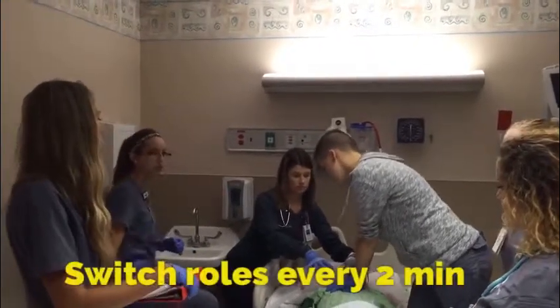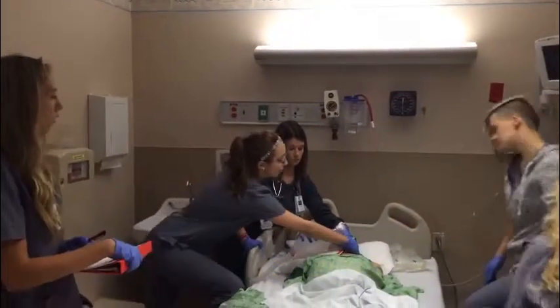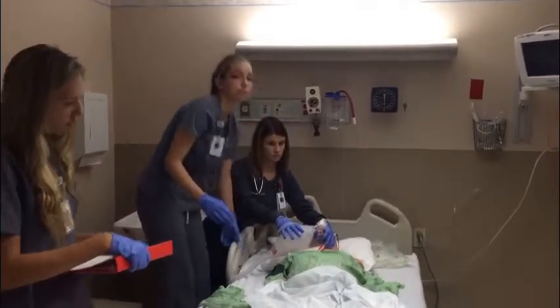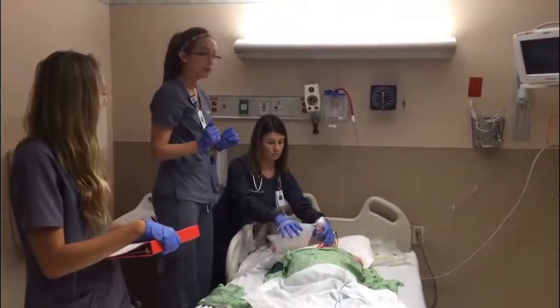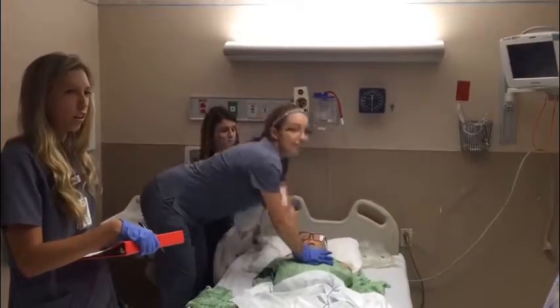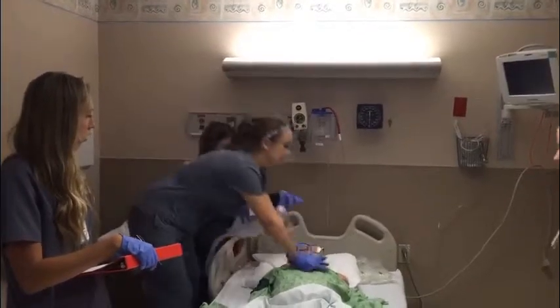It's been 2 minutes, guys. Let's get a pulse check and switch compressors. Go ahead and begin charging. Charging. Yep, no pulse. Go ahead and defibrillate at 150 joules. Clear. Shocking. Shock delivered.